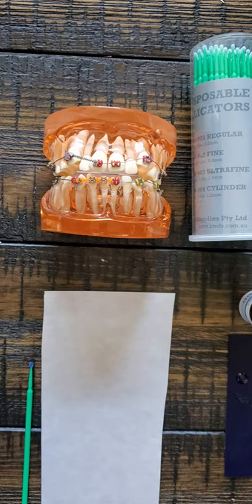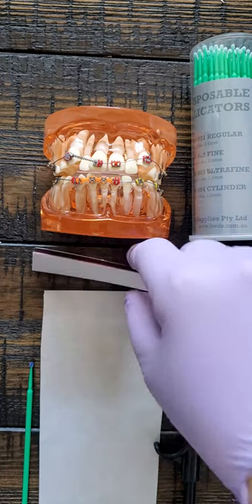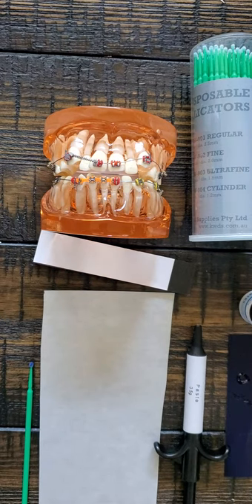Hey, this is Dr. Amanda with Straight Smile Solutions, straightsmilesolutions.com, and today we're going to talk about putting on posterior bite bumps — how do we do that, why do we do that, and what's the easiest way to do that? I'm going to go ahead and show you.